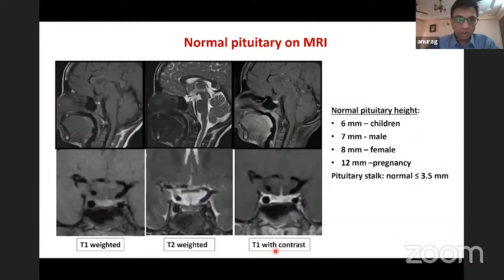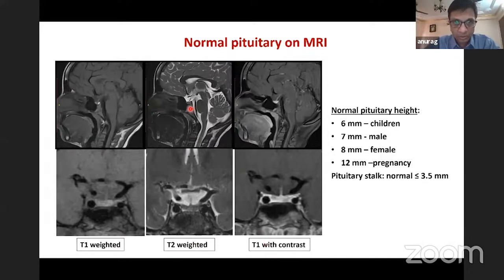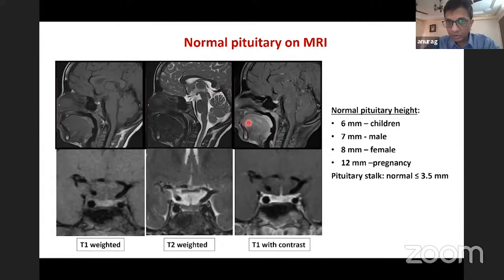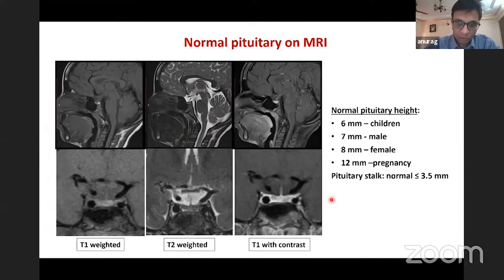As we all know, for pituitary imaging we have to see T1, T2, and T1 contrast — these are the three basic images. We know how the pituitary looks, how the stalk looks, and how contrast uptake appears. The posterior pituitary bright spot is present. Height in children is up to 6 mm, males 7, females 8, and in pregnancy it can be higher. The stalk is measured at the base and should be less than 3.5 mm. If it is thick or tubular, that is a problem.